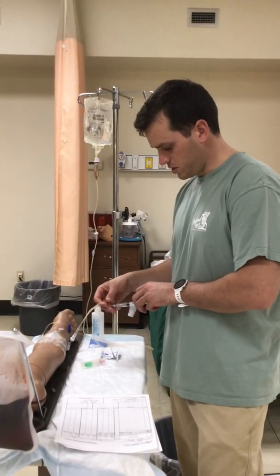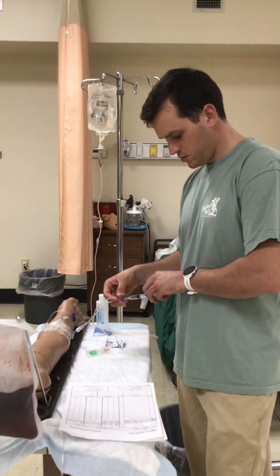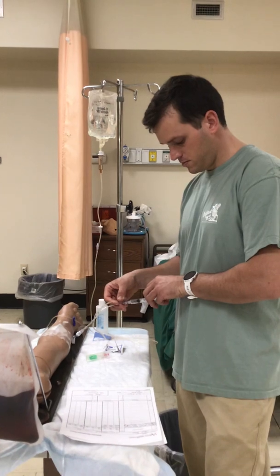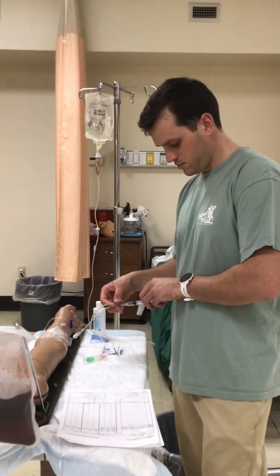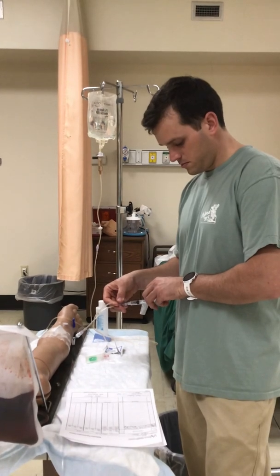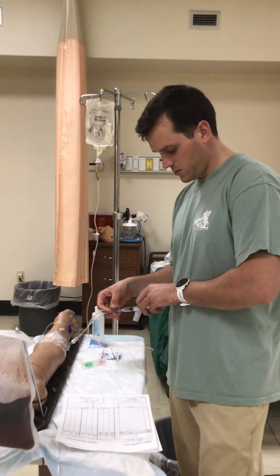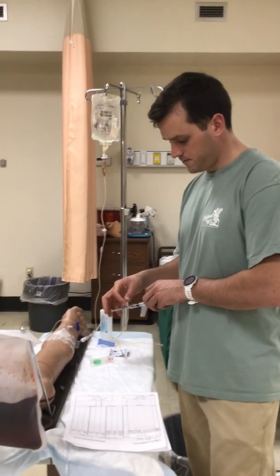Here we go. I'm going to pinch, administer, release, flush it.